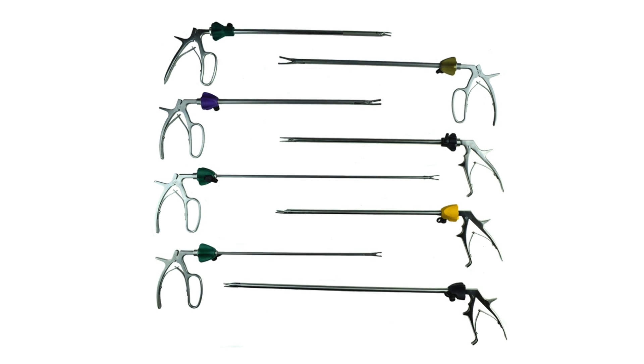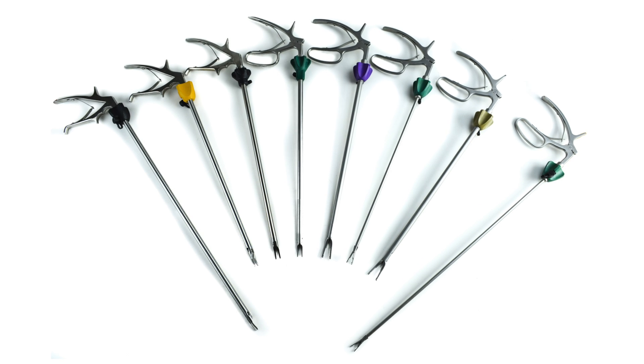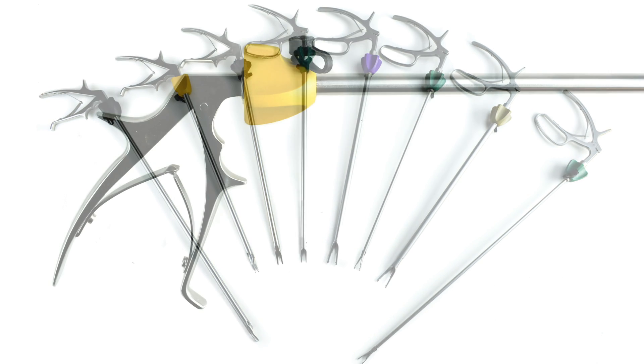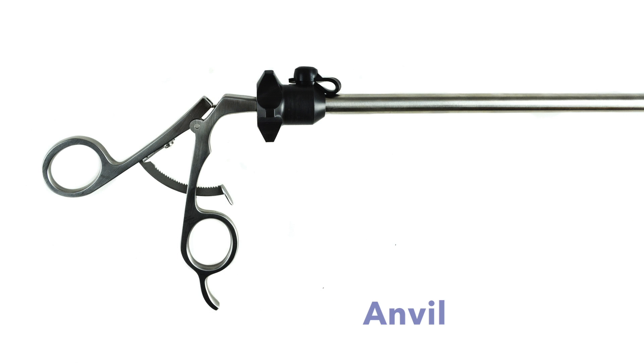Welcome to AED's Feature of the Month, where we showcase our high quality endoscopy products. This month we're featuring our line of reusable laparoscopic clip appliers: AED clip appliers designed for Ethicon and wet clip systems, Hemolock polymer clips, and the Anvil Clip Applier.